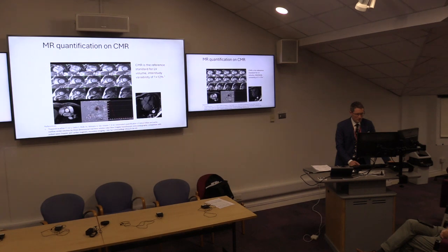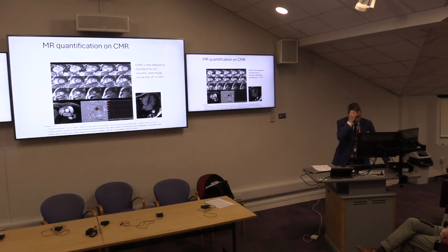what else does CMR offer you? So I used to spend my life as a PhD fellow drawing circles around the heart, but I'm delighted to say with the advent of AI, I can now do this with the touch of a button in about 5 seconds. And you get very reproducible, automated LV contours in end diastole and end systole. So CMR is by far and away accepted as the gold reference standard for LV volume quantification and function. And in fact, the interstudy variability between operators is very good.